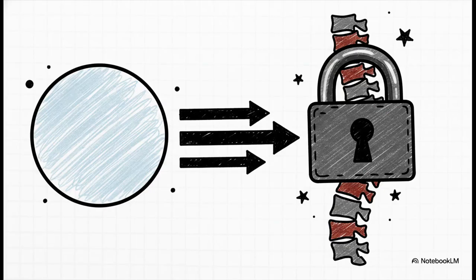That is a massive difference in outcomes, based entirely on what the functional scan is telling us. And the multivariate analysis confirms just how powerful this relationship is. When you're framing this for your next patient consult, remember that an unbelievable hazard ratio of 12.76 means an MCR is a huge, independent predictor of keeping that spinal disease in check. If the PET scan is completely quiet, the odds are overwhelmingly in favor of durable local control.